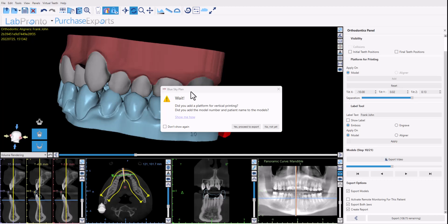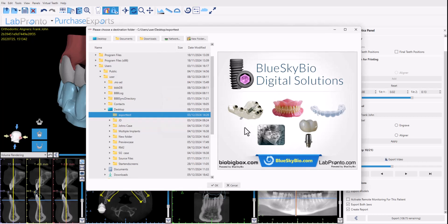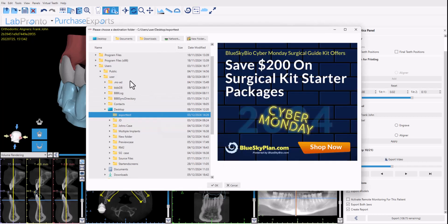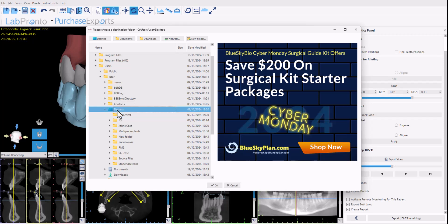A notification appears on the screen just confirming that we've added the base for vertical printing and we've added the numbering and text to the models. I'm going to click yes proceed to export and the software now prompts us for the location where we would like to export the models to. So I'm going to click desktop.